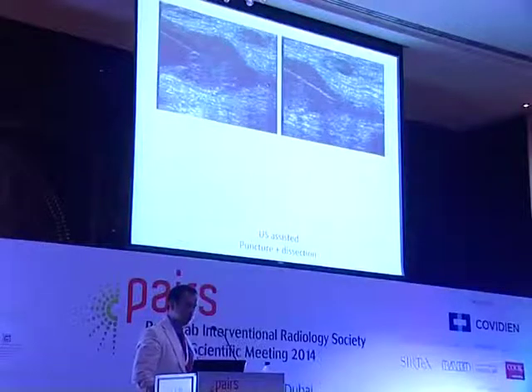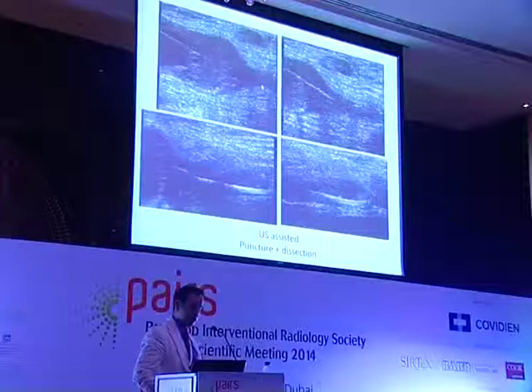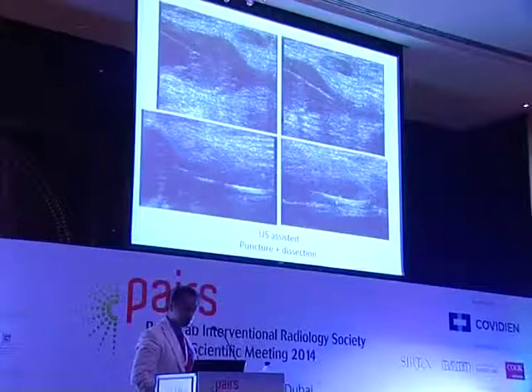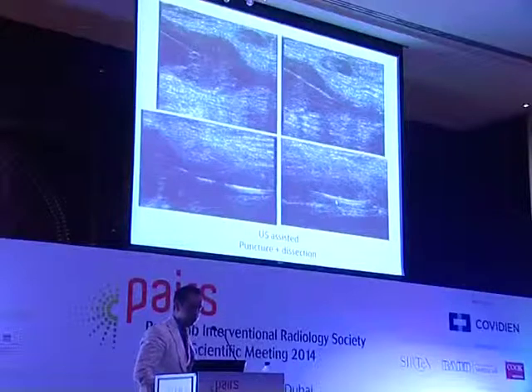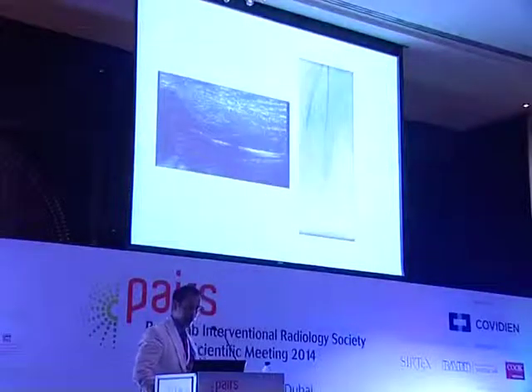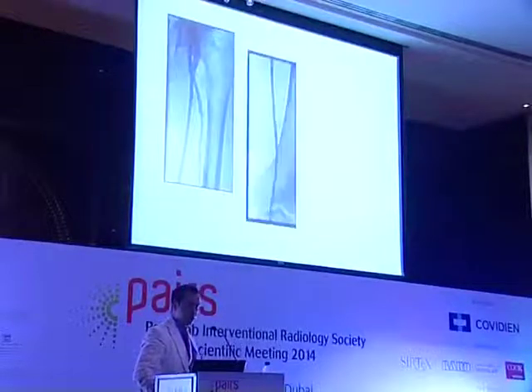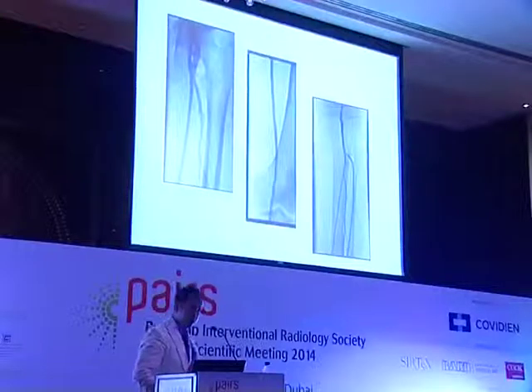You can see here the origin of the SFA occluded, and we can start the recanalization by the subintimal way with the wire here through the lumen of the vessel. We can then continue with classical fluoroscopic guidance, and finally have this result.